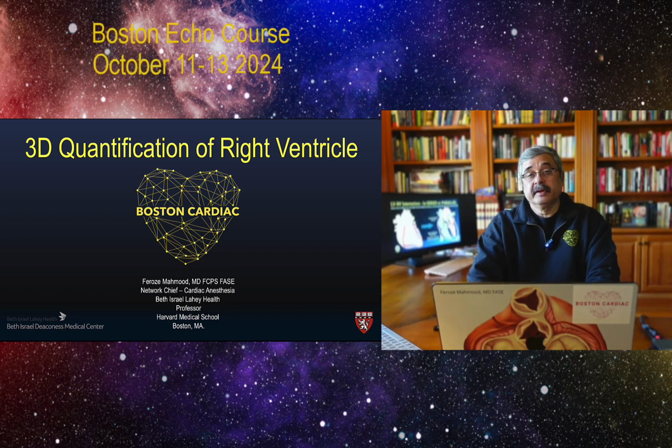Today we are going to go over a very precise, focused and short presentation on a very challenging topic, but of huge clinical interest, and that's the three-dimensional quantification of the right ventricle.